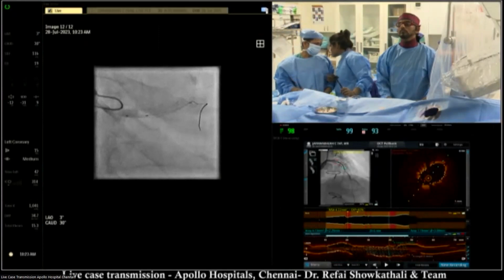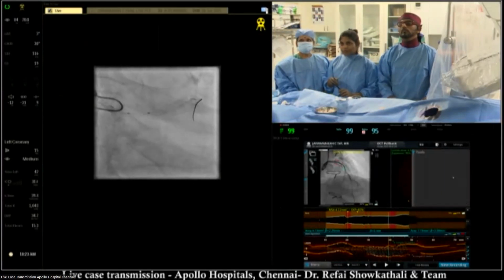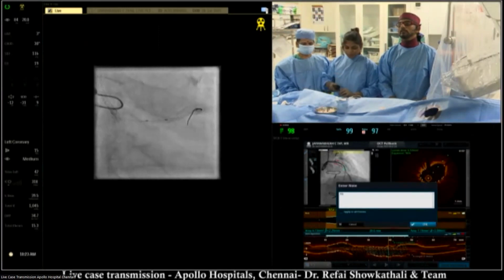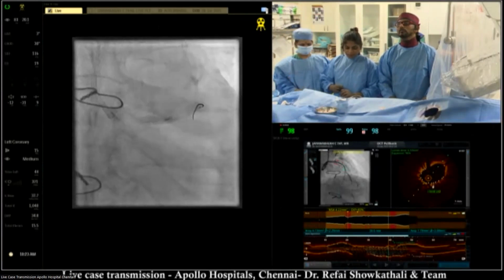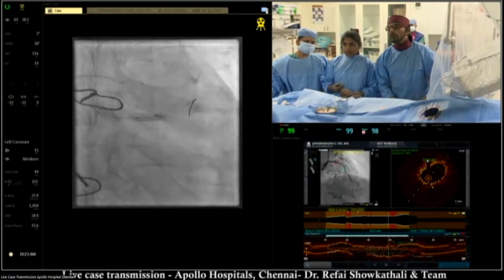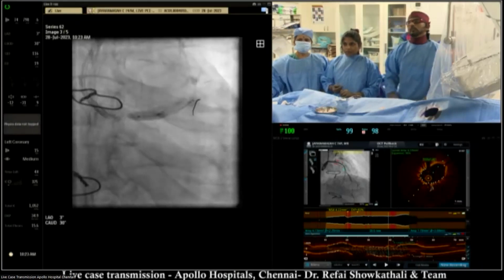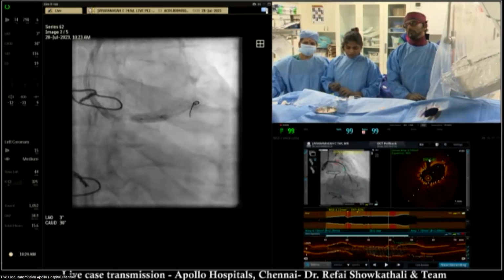I don't think so, Ashish. Actually, the recommendation initially was 6, 7, 8, 9. That is totally gone. Use the same balloon. You go a little higher. The larger the lumen area is, the better, especially for the ostial LAD, definitely. And this patient is having an LAD, such an important vessel, where if you can get an adequate or better area, it will always be better. Fine, that's very good, guys.